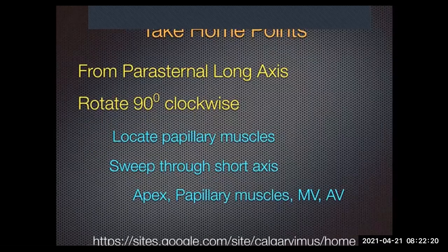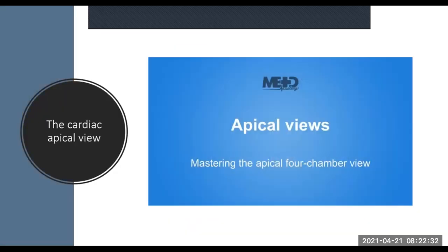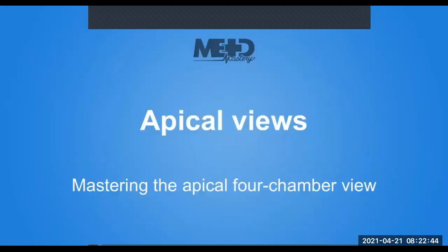So the take-home points. It's quite boring, but you can't beat the animation that they've got on these, so that's why I chose it, right? So we're going to watch one more of these, unfortunately, all right? And this is now to show us the apical views. And then after that, you'll watch the one that we did, and then we're going to go through some pathology. So don't worry, it does get better.